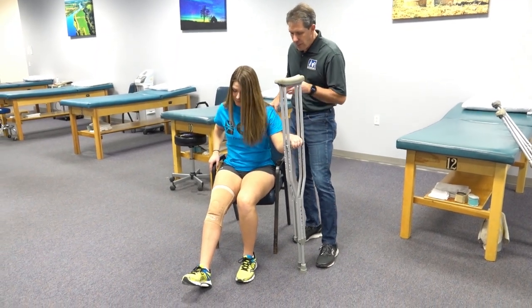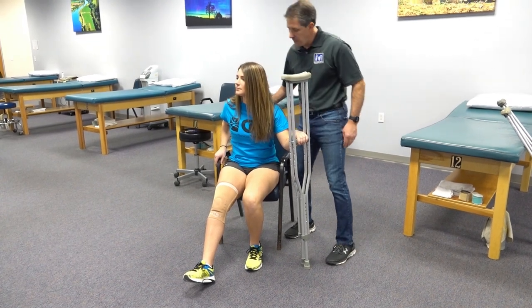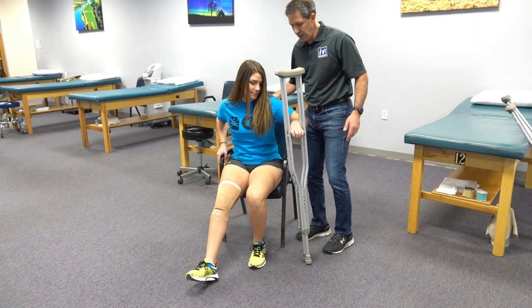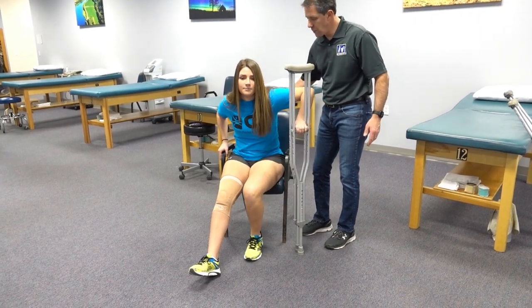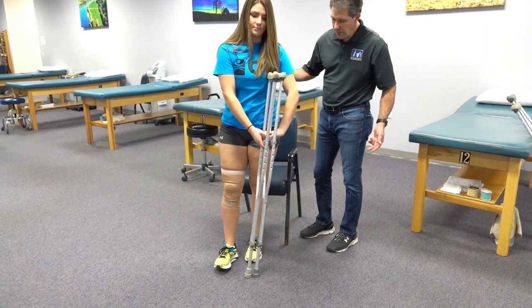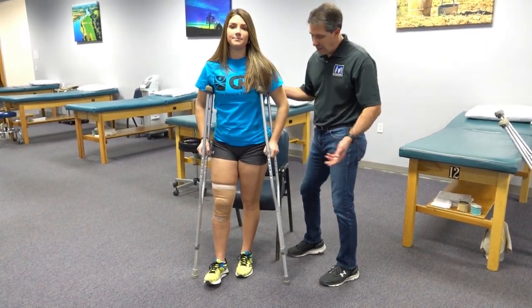Now we're going to be putting some pressure through the good leg, and with this hand on the armrest of the chair she's going to be pushing up to get up at the same time. One, two, three — and up. We bring the crutch to the other side and now we're ready to go.